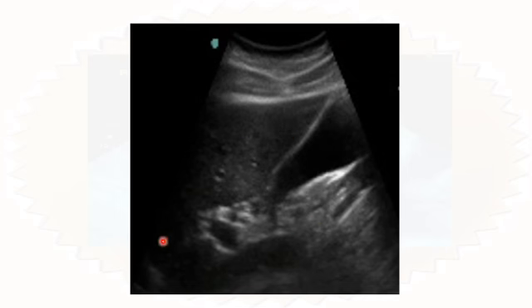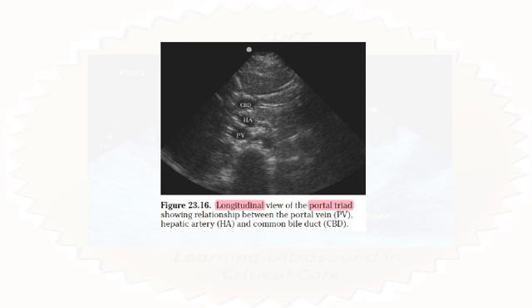So that's the gallbladder there, and that's the major lobar fissure, and that's the portal triad. When you zoom up to the portal triad, you have the portal vein here, and then you can see these two parallel lines here, the anechoic structure with these two parallel lines. That is the common bile duct. Okay. Now, normally the common bile duct must be less than half the size of the portal vein. If it becomes more than that, then it means it may be dilated. In this instance, that's the portal vein and that's the common bile duct, and you can see that the common bile duct is more than the size of the portal vein.